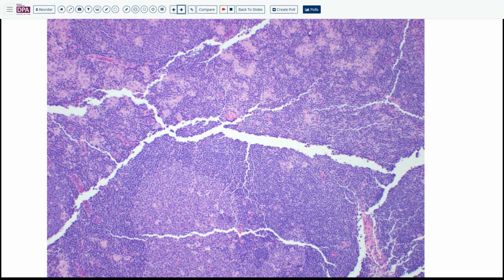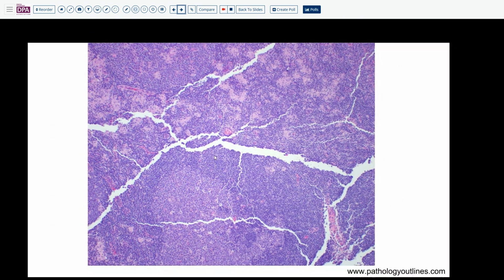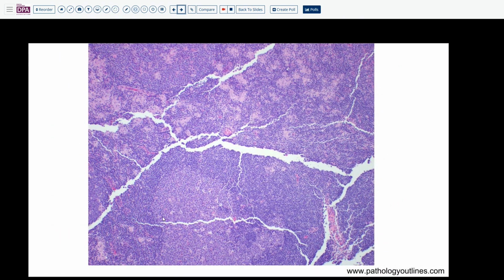This is clear, abundant cytoplasm, and they are actually B cells. Monocytoid B cells are usually related to chronic infection, so when you see them, it should be related to infection. So this is the triad of follicular hyperplasia, epithelioid histiocytes, and monocytoid B cells.